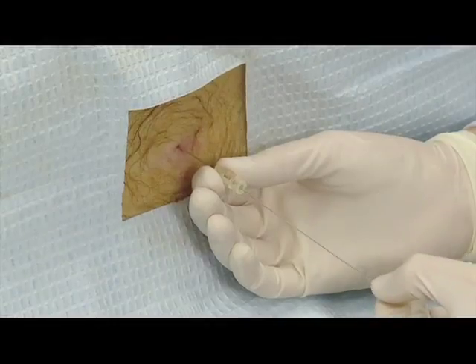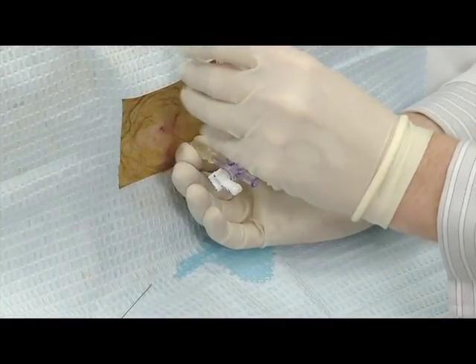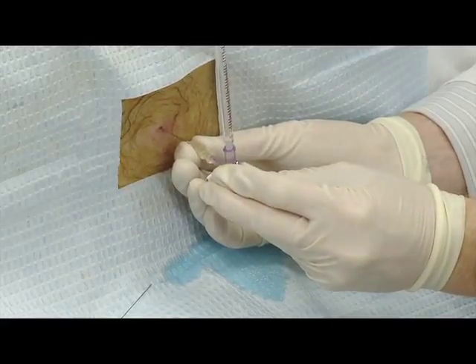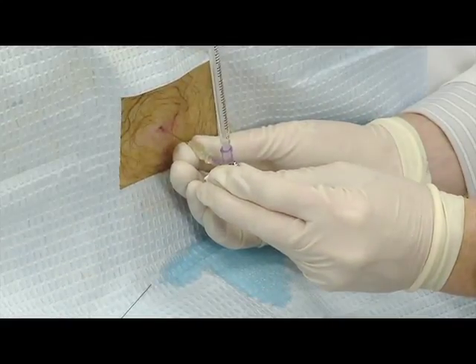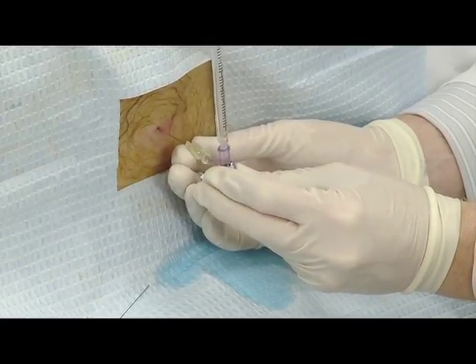Once you have CSF, remove the stylet and attach the manometer to obtain an opening pressure. Open the stopcock valve toward the manometer. To obtain an accurate measurement, instruct the patient to carefully extend their legs fully and relax.